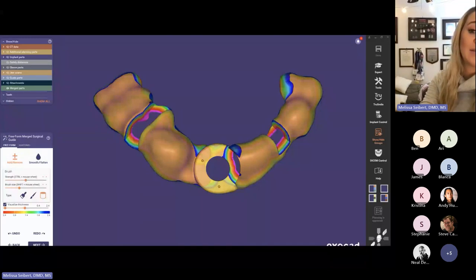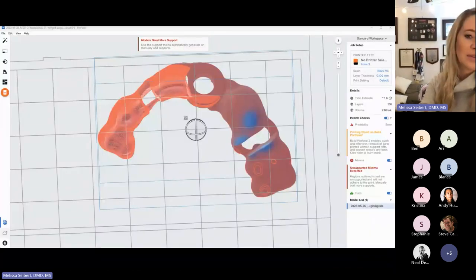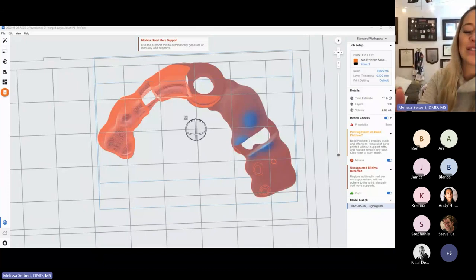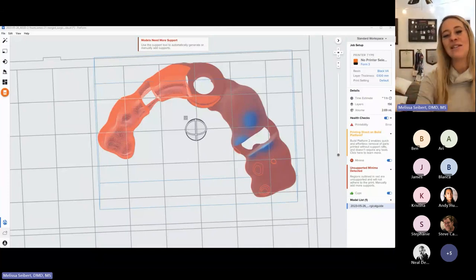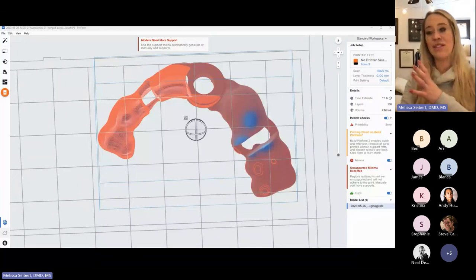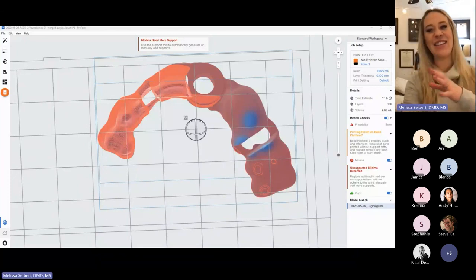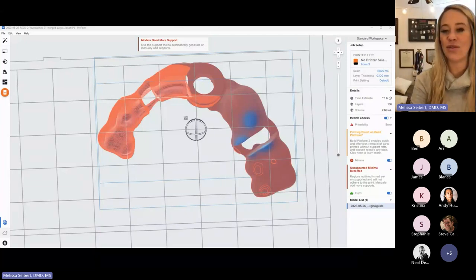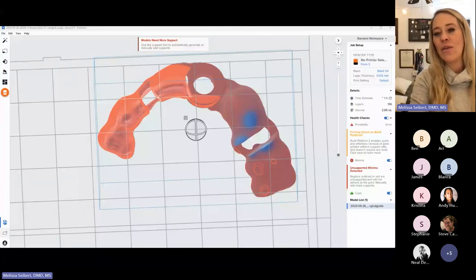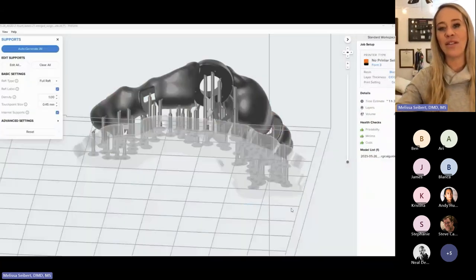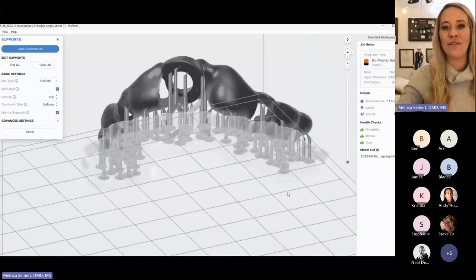From there, I use the Formlabs printer to get it printed. One important thing for your own knowledge: the placement of the guide for printing is pretty important. You do not want the intaglio surface of the guide being printed with supports. I know this because I made this mistake — all the supports were on the intaglio surface and the guide was a total waste and had to go in the trash. But even that wasn't the end of the world, because printing is so cheap that we just redid it. Here's the correct positioning of my guide.